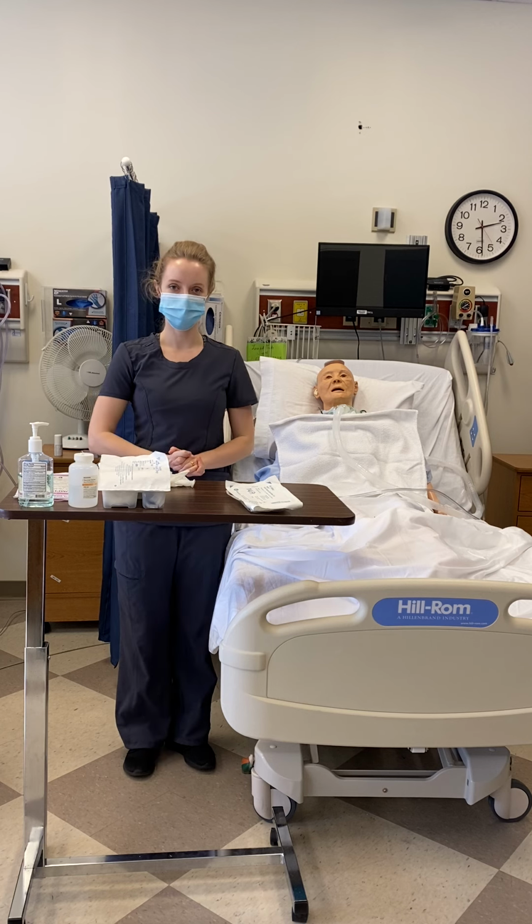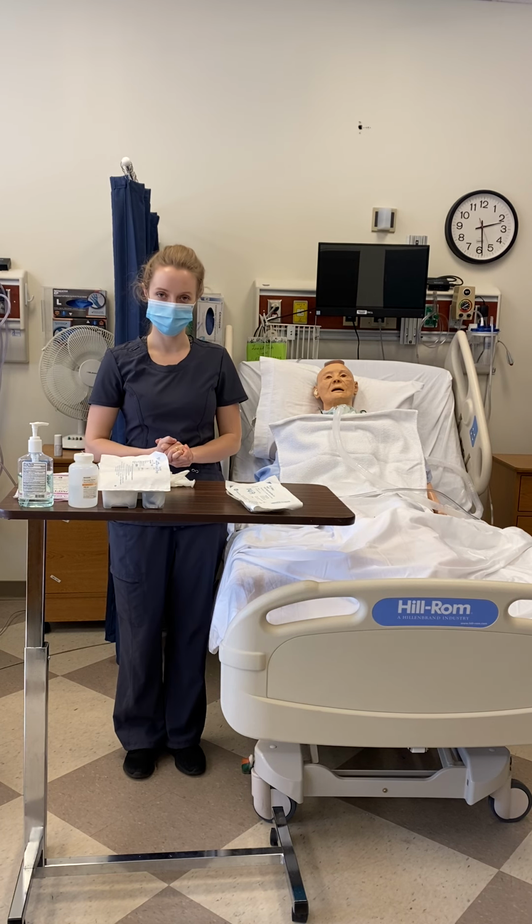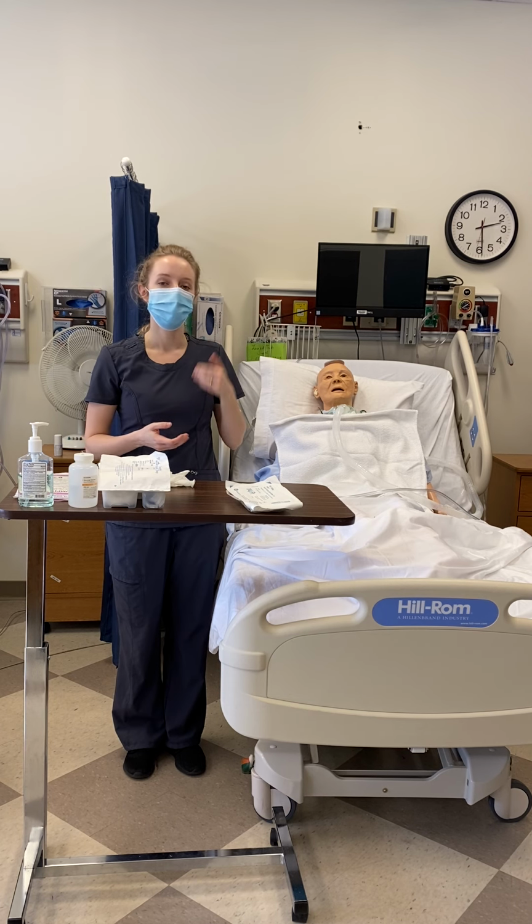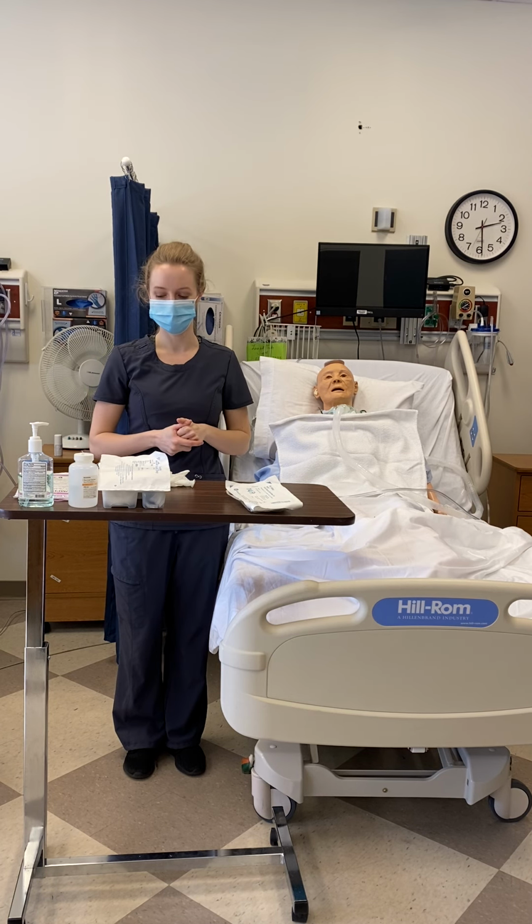My name is Grace Reese and I'm an 8th semester nursing student at Lincoln University, and today I will be demonstrating nasopharyngeal and tracheostomy suctioning along with providing trach care to my patient.